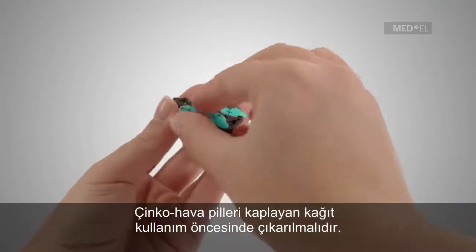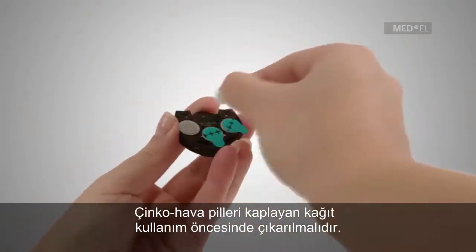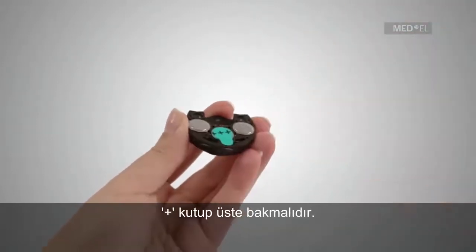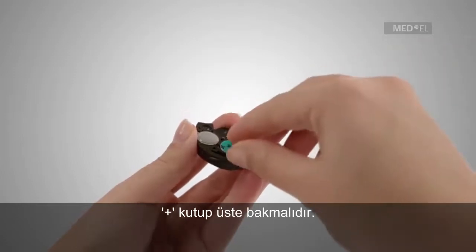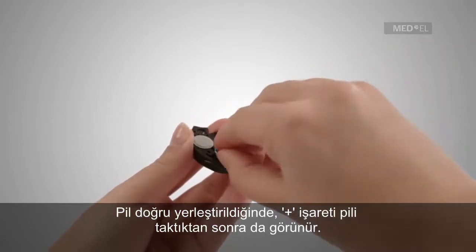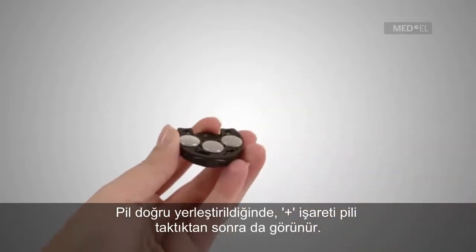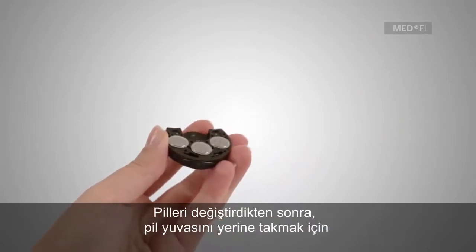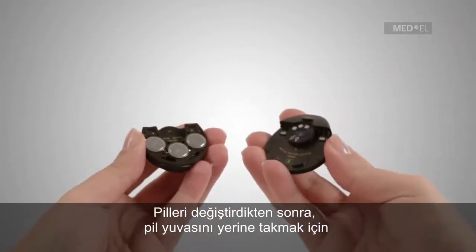The foil covering the zinc air batteries must be removed before use. Ensure that the plus pole is facing outward. When correctly inserted, the plus sign will still be visible after insertion.